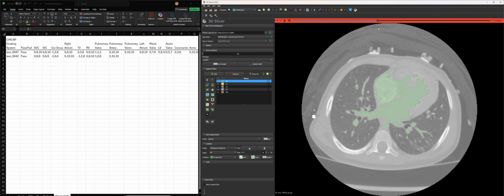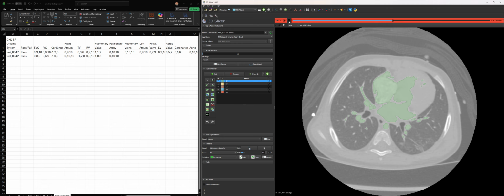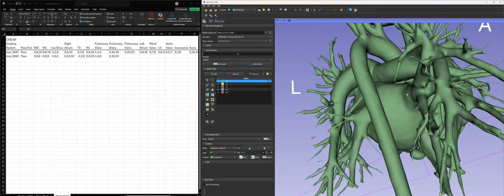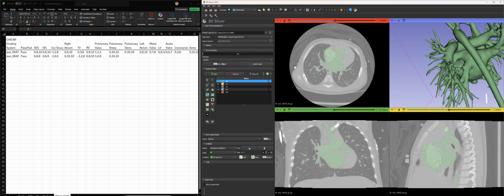How do you like it? And I'll go back, and I was looking at this earlier, but I'll show that. Okay, I have what I like, and it is a 0, 10, 10. Left atrium.